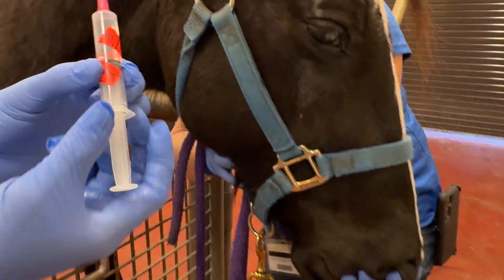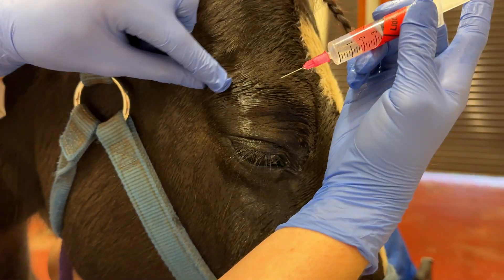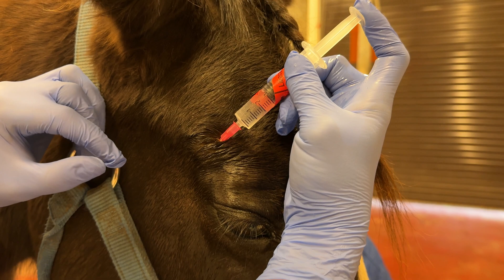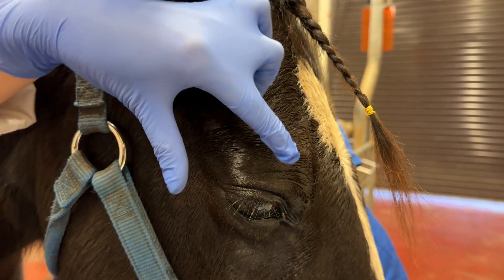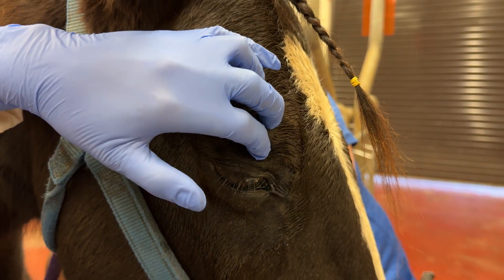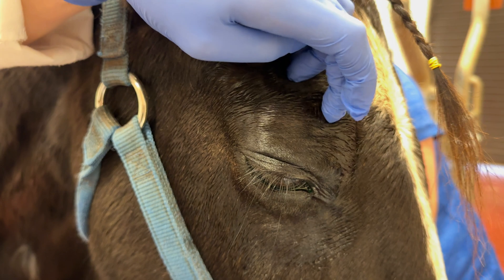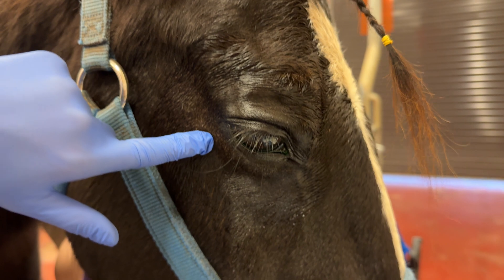Next, we're going to block with lidocaine. We're going to start with our regular palpebral block, so I palpate over the zygomatic arch and inject one mil there. If I was going to be placing an upper eyelid lavage line, I would palpate and feel right here for our notch to do the supraorbital block. But we're going to focus on the lower instead.